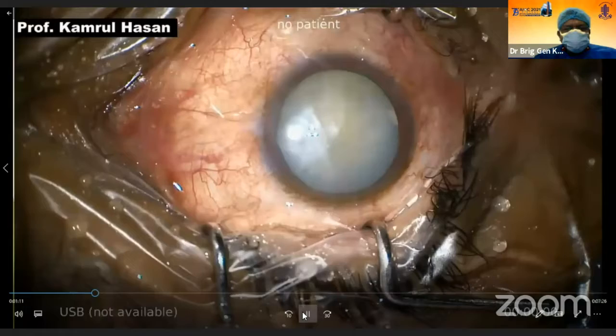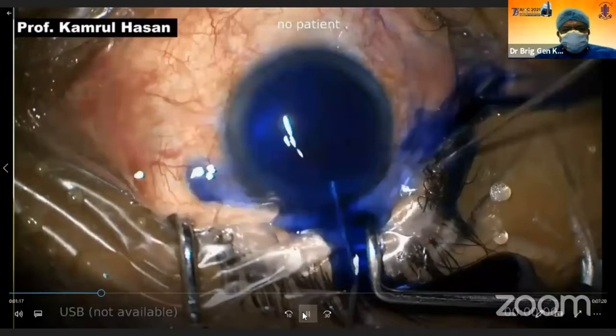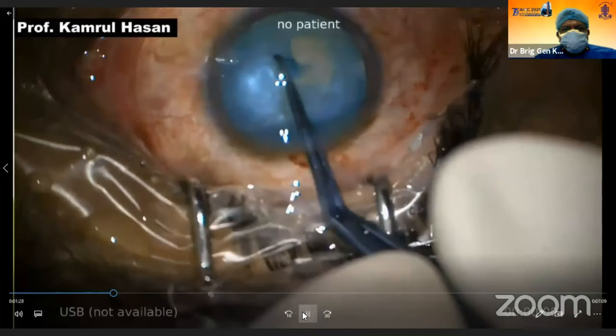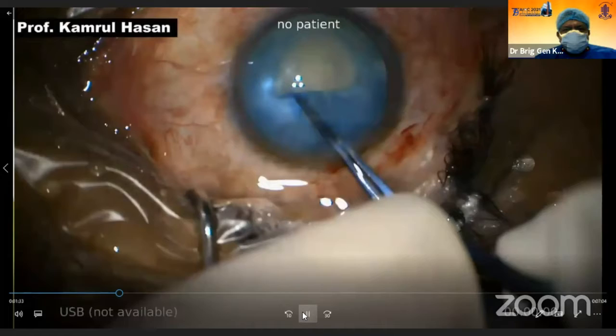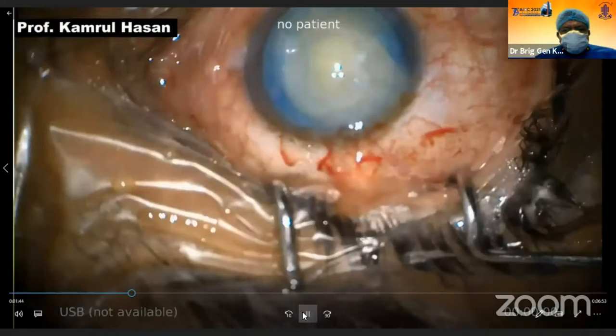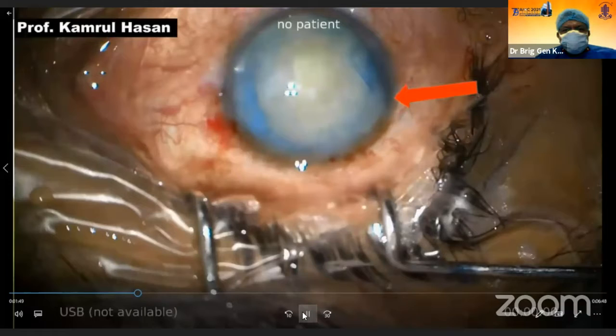You see, it usually happens in white, milky white cataracts. This is a case where I just started the capsulorhexis. It's going fine, using the capsulorhexis forceps. Things are going okay. And you can see here is the shear force which extended further. So I cut the margin with the Vannas scissors, formed the chamber with viscoelastic, and rotated the nucleus.